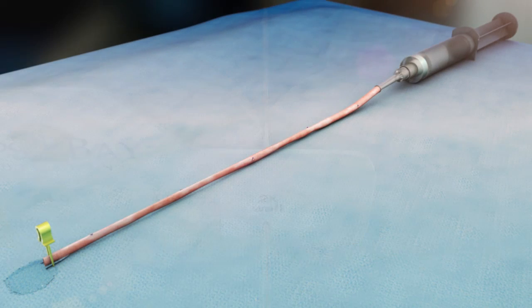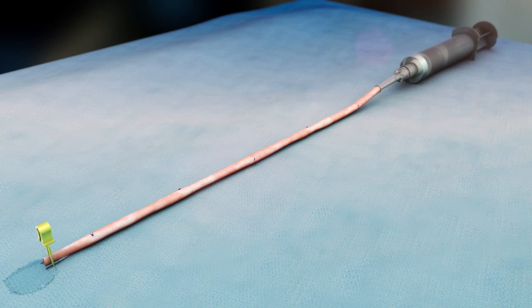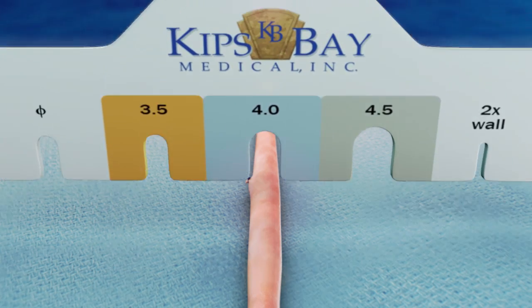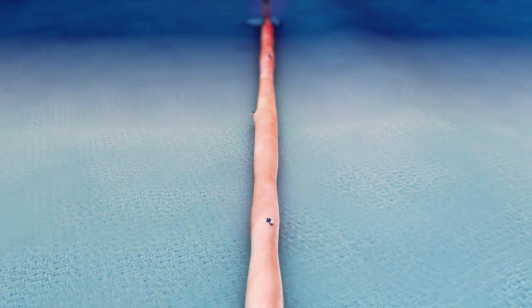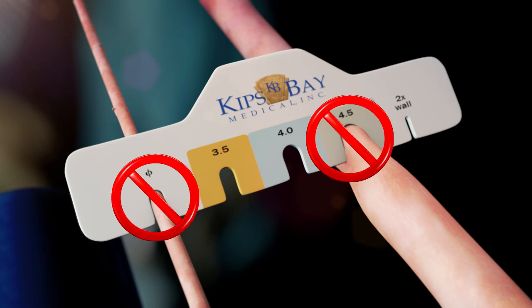The next step in qualification is to assess the outside diameter of the fluid-filled vein. Clamp the distal end of the vein. Gently fill the vessel with heparinized fluid until it takes its natural round shape. To avoid potential luminal injury, do not overfill the vein. Using the sizing tool, attempt to fit the largest sections of the filled vein into the slots on the tool, beginning with the null symbol slot and ending with the 4.5 mm slot. The smallest slot into which the segment fits without deformation indicates by size and color code which size mesh to use. If the target vein fits easily within the null symbol slot or is too large to fit within the 4.5 mm slot without deformation, then the vein's outside diameter does not qualify for use with the mesh.